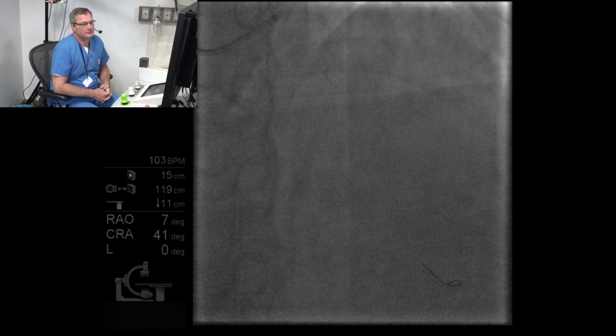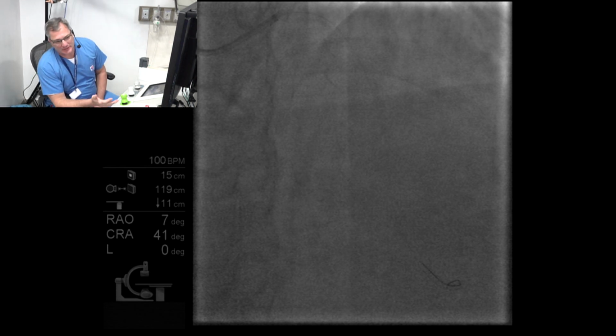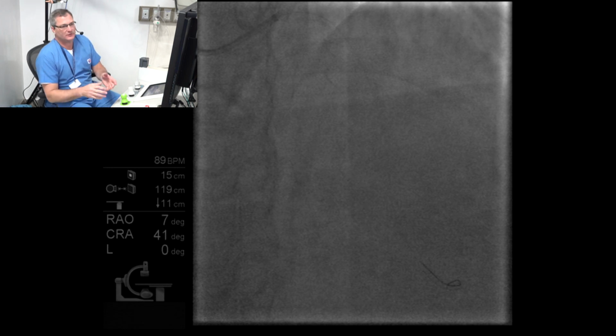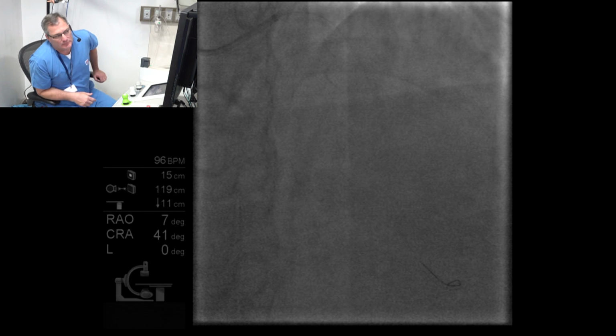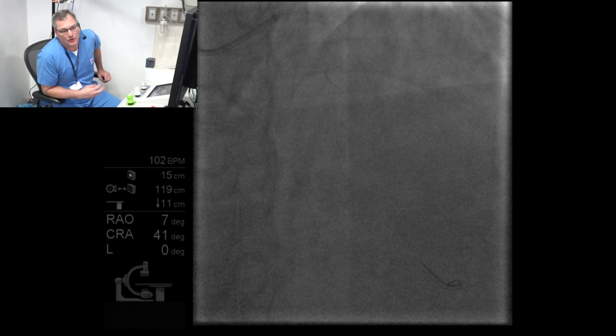This is where it's handy if your cockpit is in the other room and you trust your team really well. You can start your chart work or do something to maximize your efficiency while they're doing balloon exchanges. These guys only take a minute. A new tech will take 2 minutes to do a device exchange until he or she has done 20 or 30. This crew is very fast.